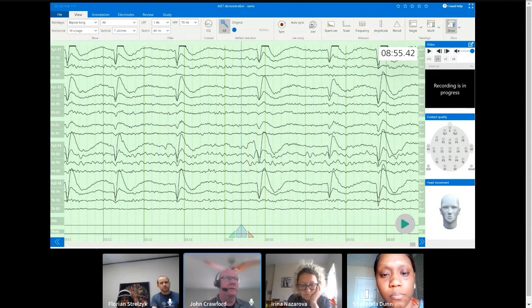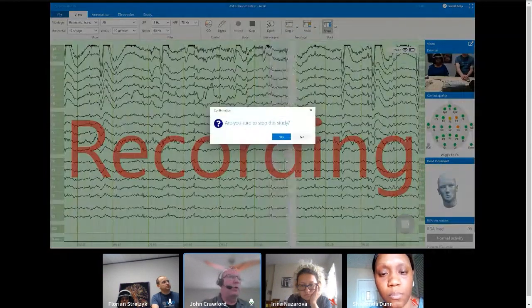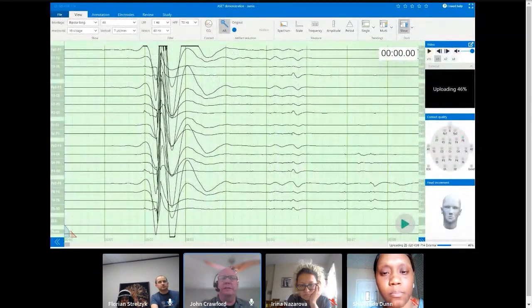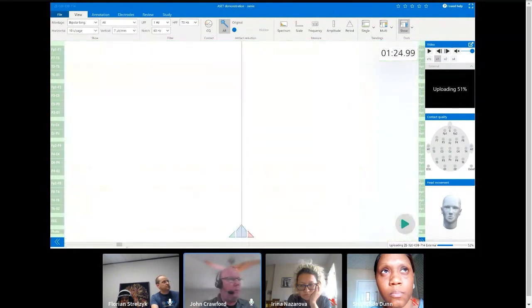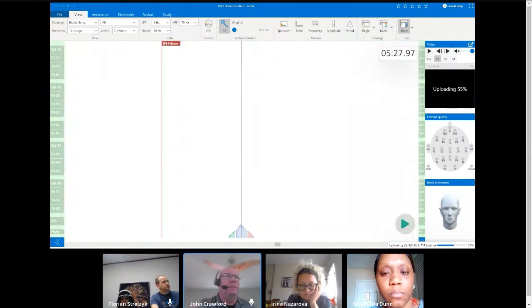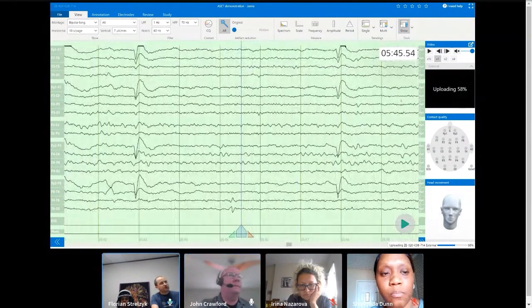That's just pure physics. However, once the person stops, the EEG will record and come back to normal fairly quickly, just like you see with traditional EEG, when the seizure's over and they stop banging their electrodes back against the bed or against the side of the bed, it returns to normal. Same with us. And now that it stopped the recording, you also see the high resolution video uploading.